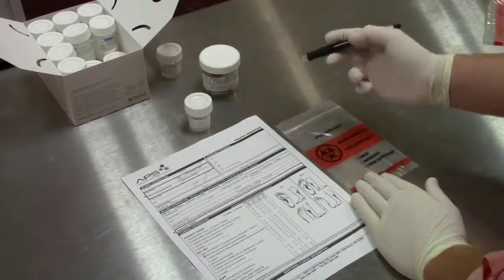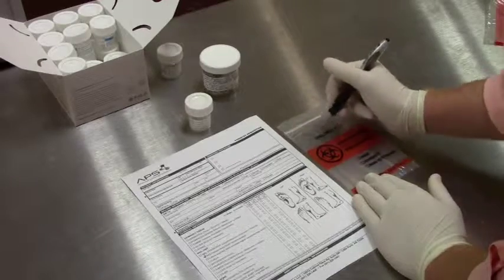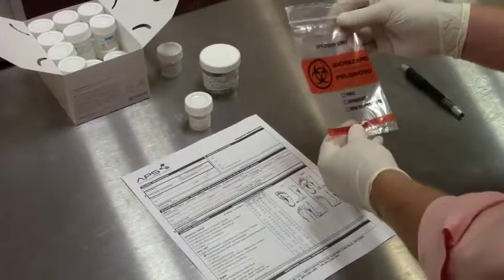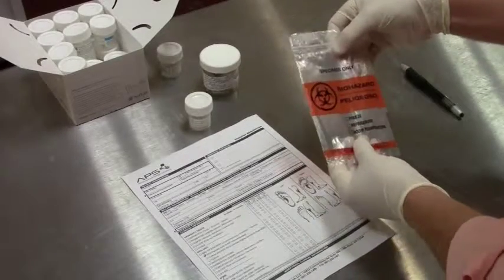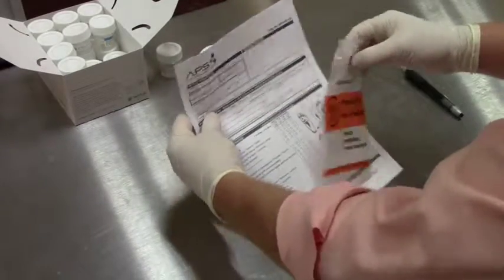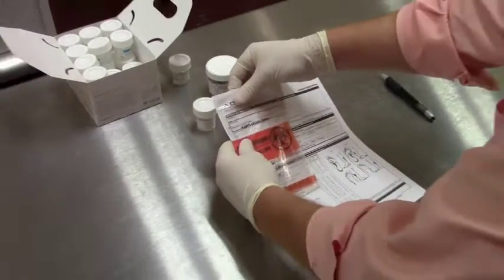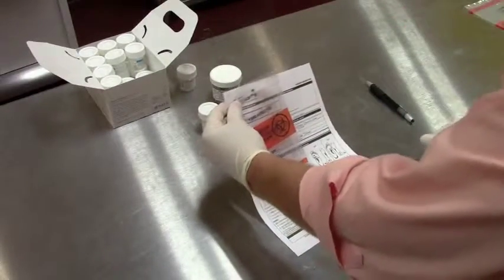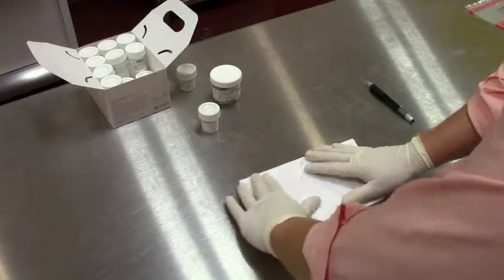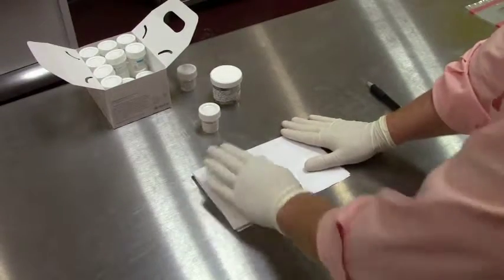Then with a Sharpie on the outside of the bag, if you would just put on there left foot or right foot and what digit it was from. If you do have a nail specimen, and once you have it labeled, what we like to do for these is, once you have the patient requisition form filled out with the billing information attached to the back, we like to just take the biohazard bag, stick it to the front, and staple it all together. And then you can fold these up, and you can ship as many as you need to, all in there together.